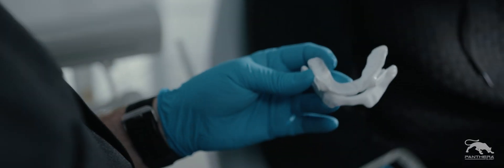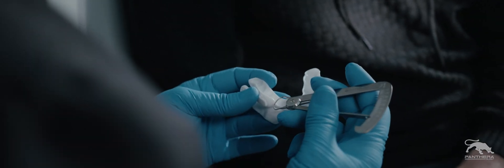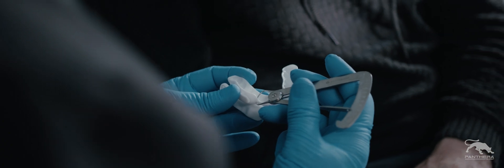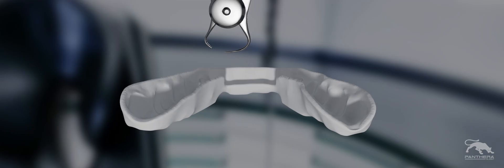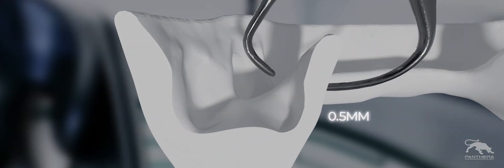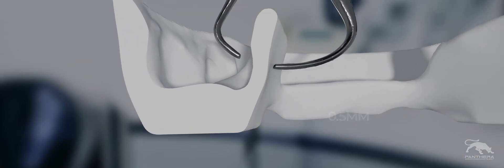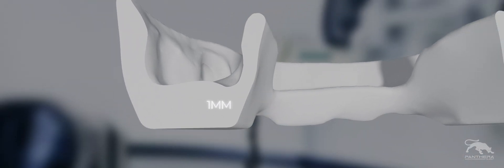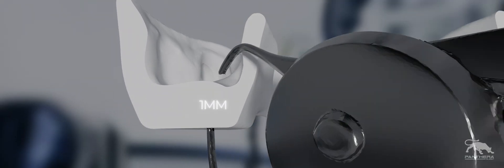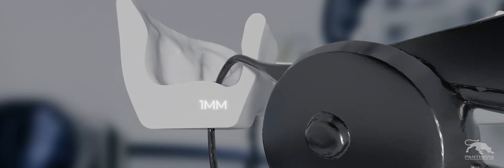Assess frequently the fit in the patient's mouth and the thickness of the material using the caliper. A minimum thickness of 0.5 mm of material on the sides and 1 mm at the level of the plateaus is required to maintain the integrity of the oral appliance.